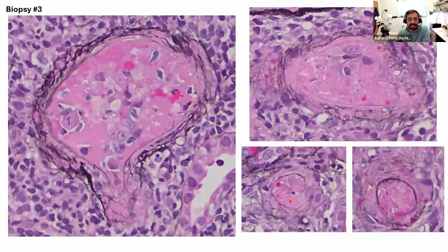So vessels like this, we can label as a lupus vasculopathy. This is where those immune deposits are really large and narrow or occlude arterial vessels. And then vessels like this, it's a little bit harder to make out, is it just vasculopathy, or some of these cells might indicate true vasculitis with cells infiltrating the vessel wall.